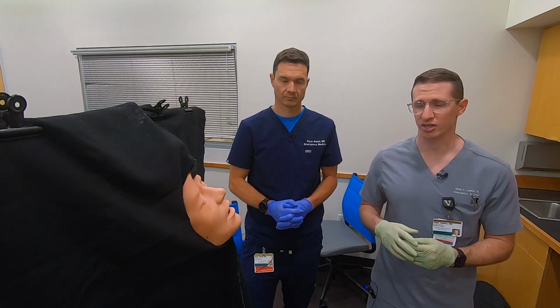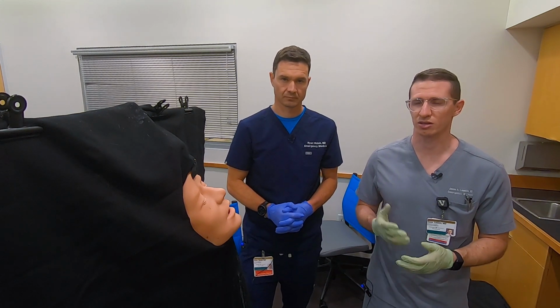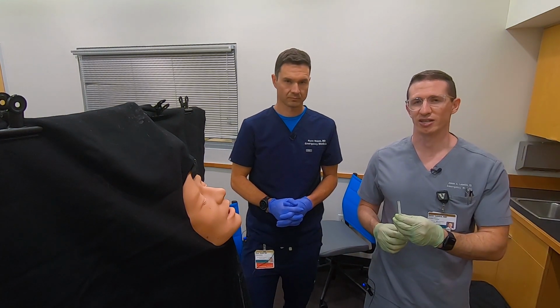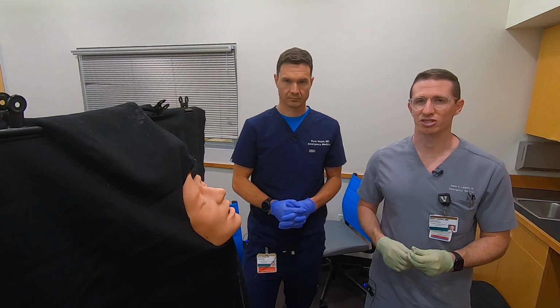We like to then proceed with a topical anesthetic such as lidocaine spray to the back of the throat, as well as using some injection of lidocaine with epinephrine using a 27 gauge needle.